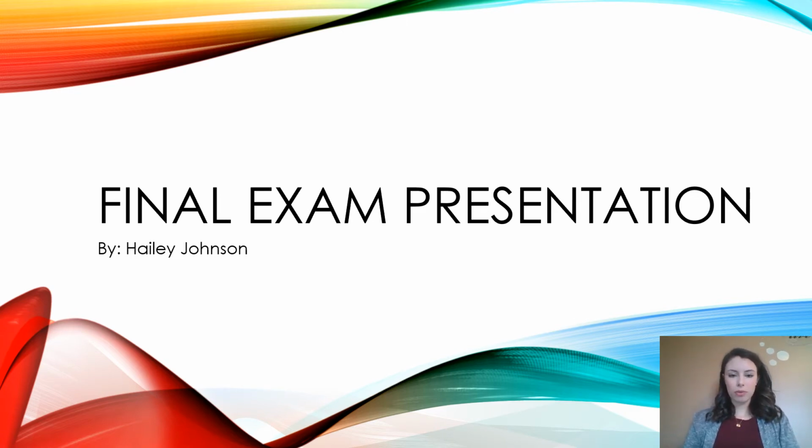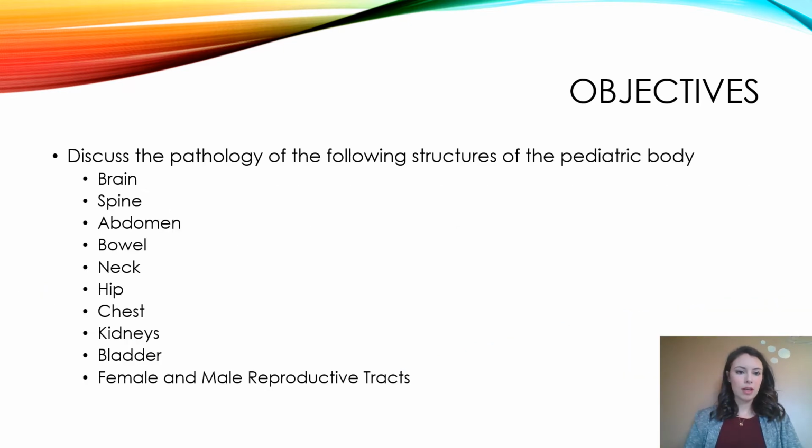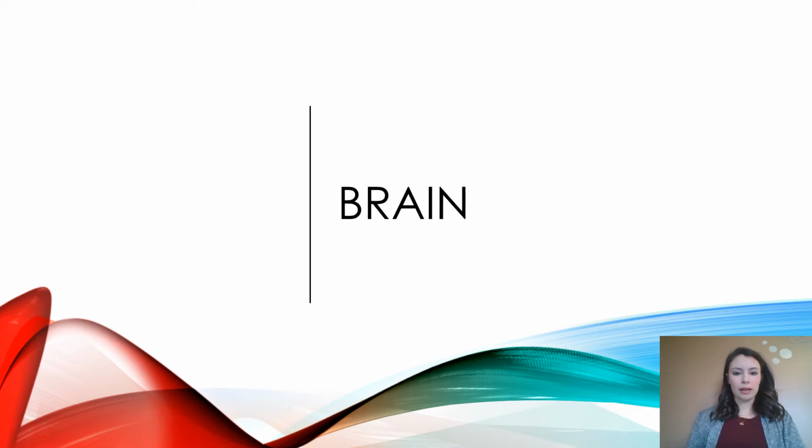This is my presentation of the final exam for our pediatric sonography class. So the objectives of this video is to just discuss some pathology that we've learned throughout this course, and those include the brain, spine, abdomen, bowel, neck, hip, chest, kidneys, bladder, and male and female reproductive tracts. So starting with the brain.